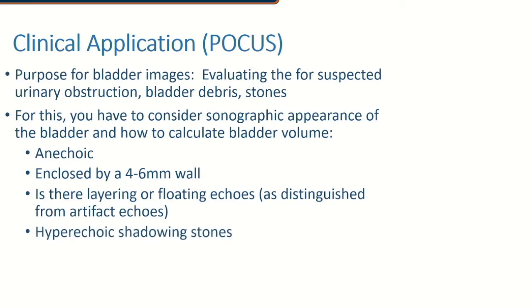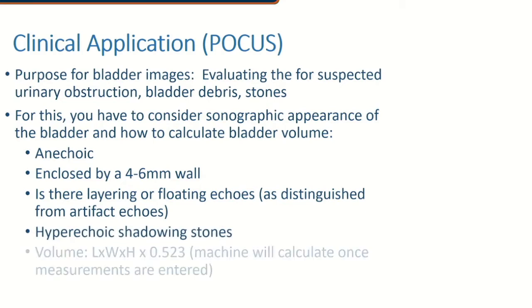Look for any hyperechoic shadowing stones. And volume is a calculation of length times width times height times a constant of 0.523. Fortunately for you, the machine will calculate once you've entered those measurements into the package, and I'll show you how that's done as well.